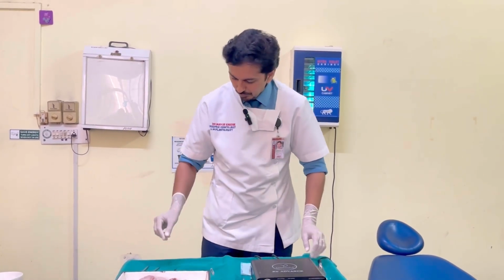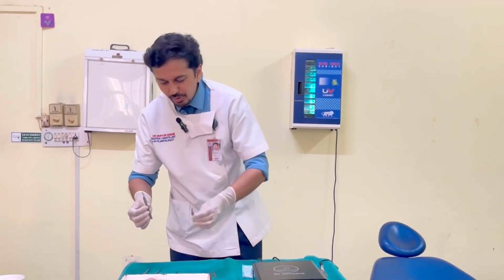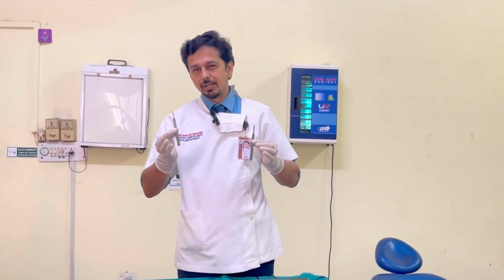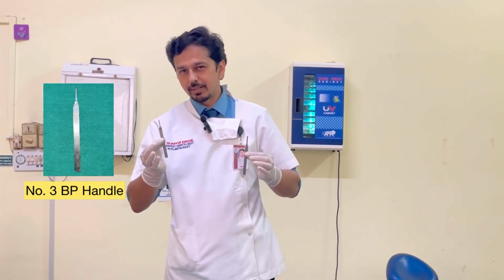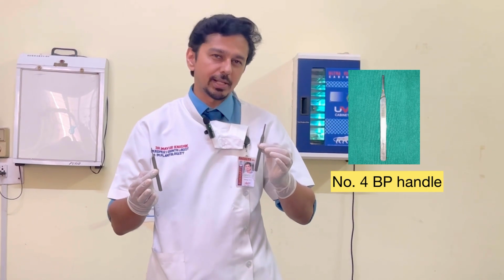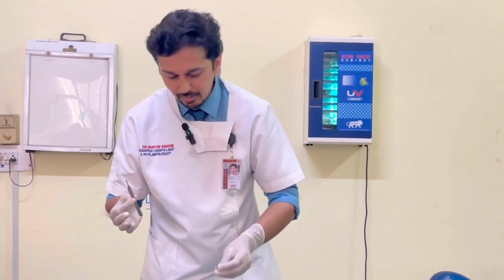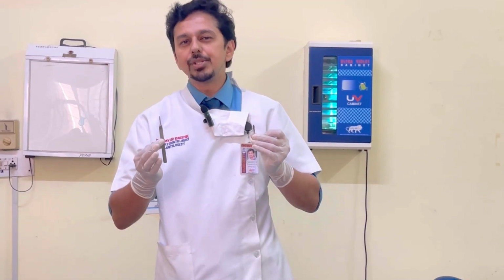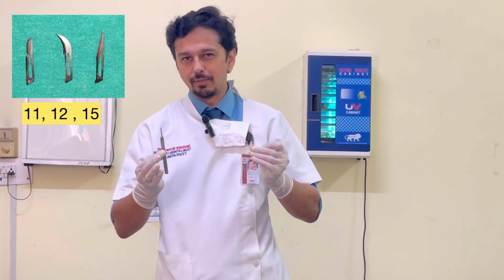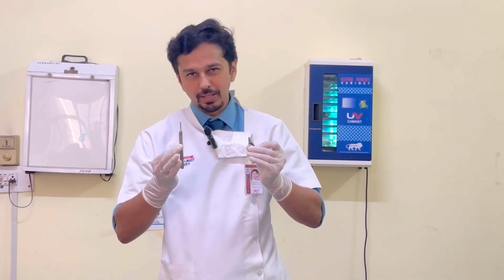Now, with regard to scalpel, that is the BP handle, there are two types of BP handles. One is number 3 BP handle, that is the surgical BP handle, and one is number 4, that is the prosthetic BP handle. In number 3, the surgical BP handle, we attach small surgical blades 11, 12 and 15. These are the blades which we will be using in the oral cavity.